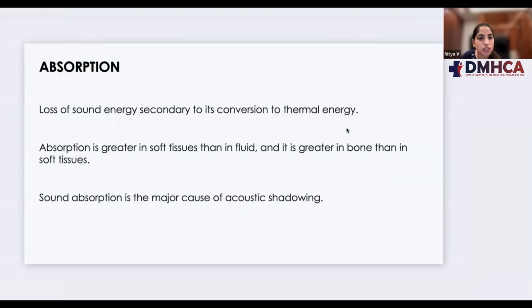So coming to the absorption of sound. Once the sound wave is reflected or refracted, it is converted into thermal energy. When it is converted into thermal energy, it causes loss of sound energy. Absorption is greater in soft tissue than in fluid, and it is greater in bone than in soft tissue. Sound absorption is a major cause of acoustic shadowing. The more the object absorbs the sound, the more it causes acoustic shadowing.